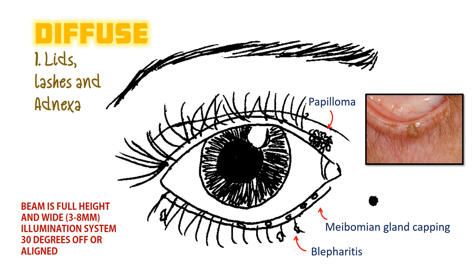Step one: examination begins with the lids, lashes and adnexa. Generally, a diffuse beam is used. This is a beam that's full height and wide, about three to eight millimeters. The illumination system should be 30 degrees off, or can also be aligned. For routine examination, I prefer magnification between 10 to 16x. Diffuse beam allows for an overview of the whole eye. Examine the lids and lashes together, top then bottom. Common pathology to look for is blepharitis, papillomas, any skin tags, or capping of the meibomian glands.